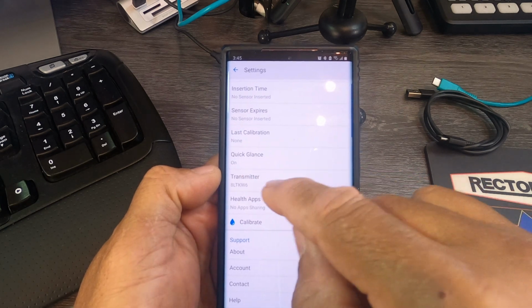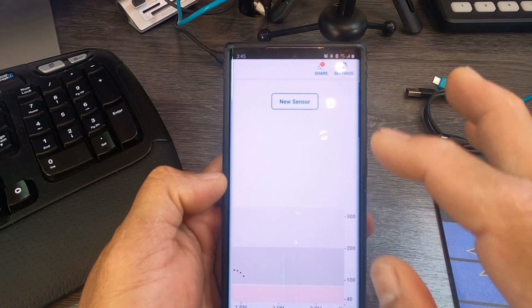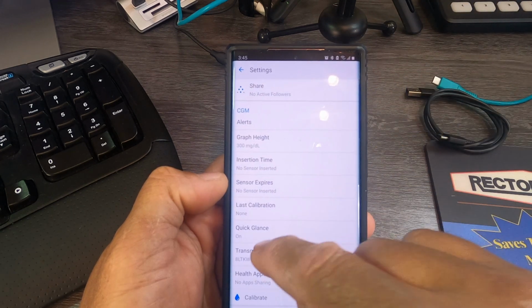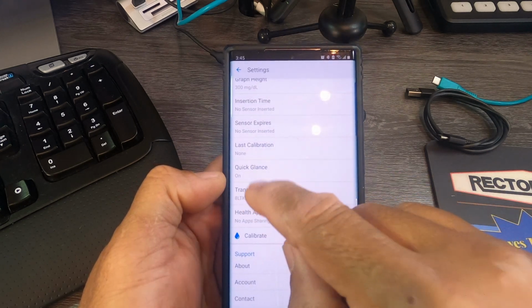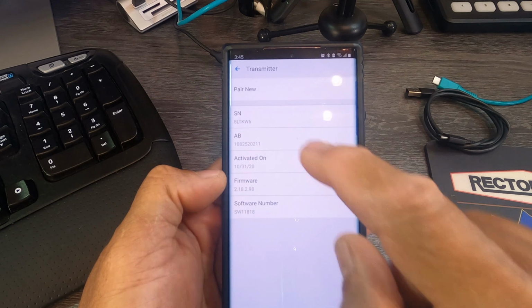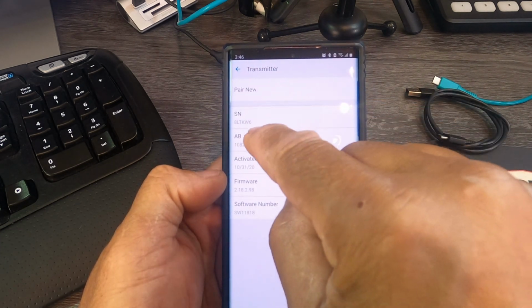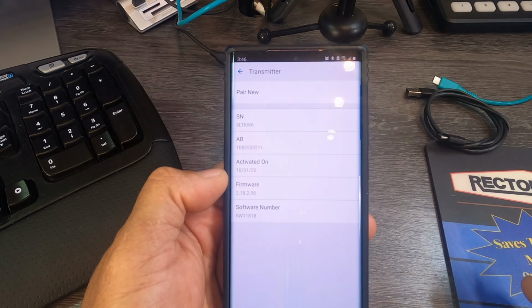Right here, transmitter, you want to tap on that. So if you go here and you start a new sensor, it's going to be looking for this one here. And the one that you have on right now might be different. So you want to make sure that you go in there and tap on there and see that, you see right here, XLTKW6. That's not the one I'm using right now.